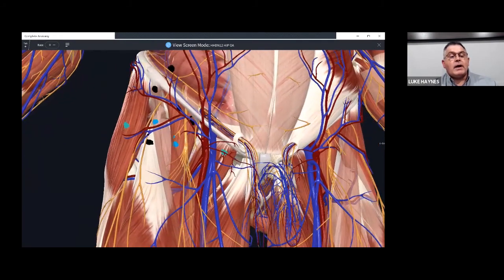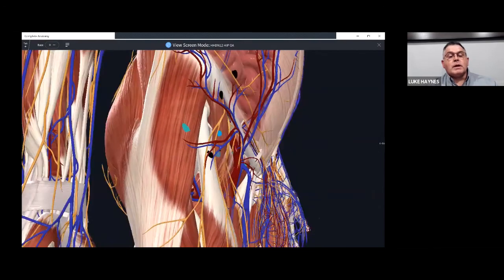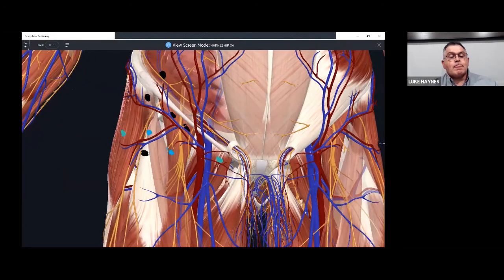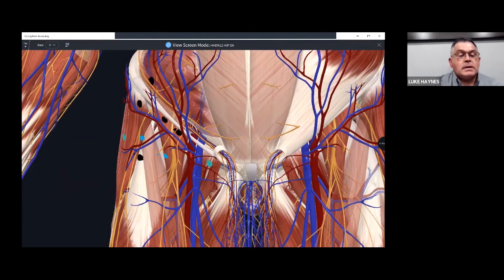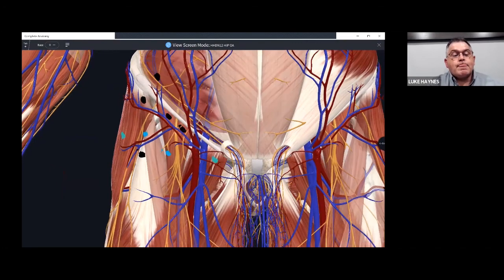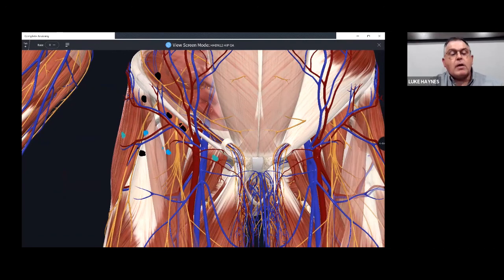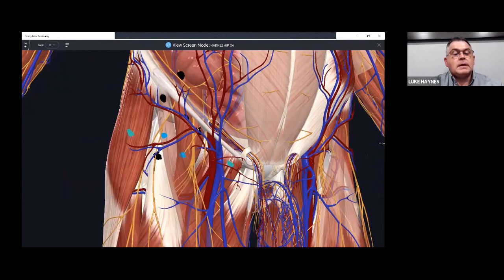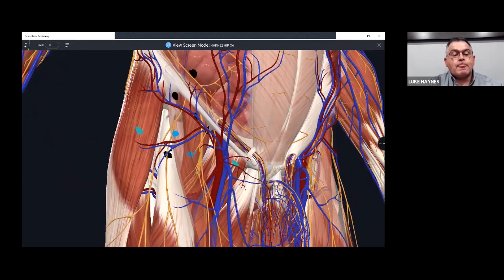Our secondary, we're going to needle into our iliopectineal ligament, which is going to be located here. We've gone over the specifics in lecture 11, the iliopectineal ligament, the iliofemoral ligament, which is our location.